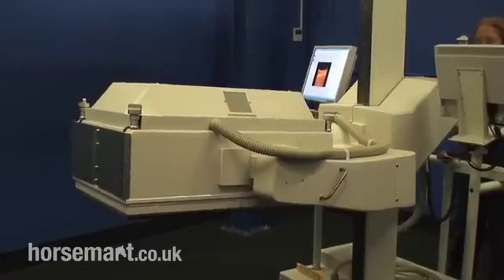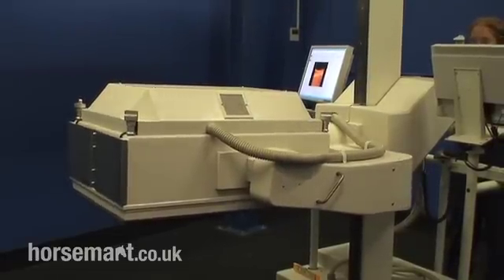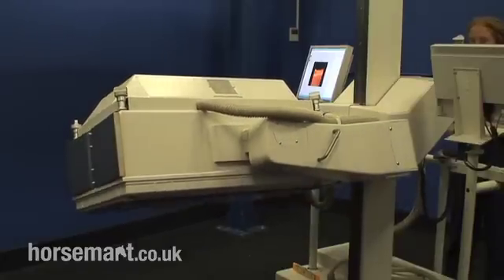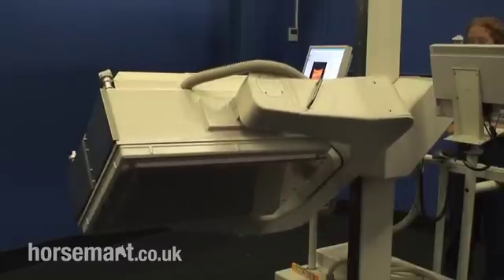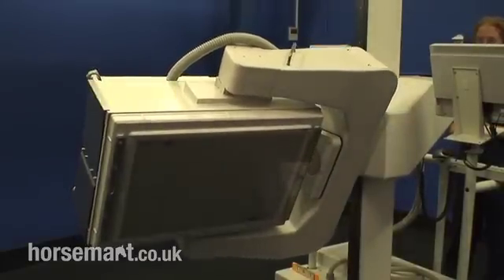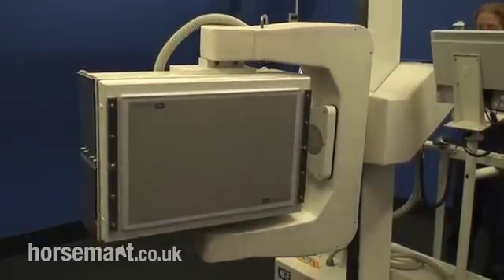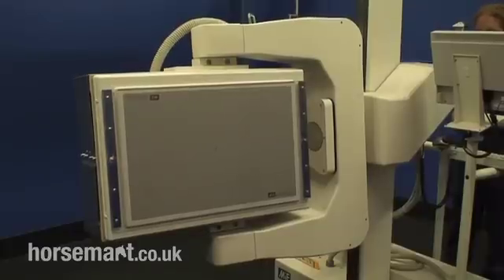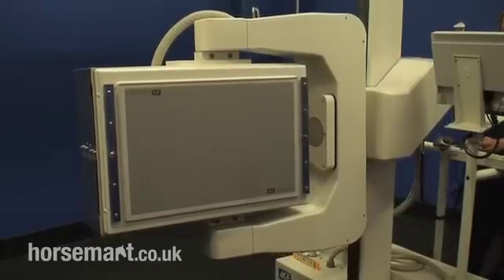It's very versatile, it's very quiet, and the horse is usually quite accepting of it. Having had this procedure done, the horse goes back to its stable and remains with us for approximately 48 hours until all that radioactivity is gone. It's passed out in the urine and feces and generally emitted. It's a very low level.